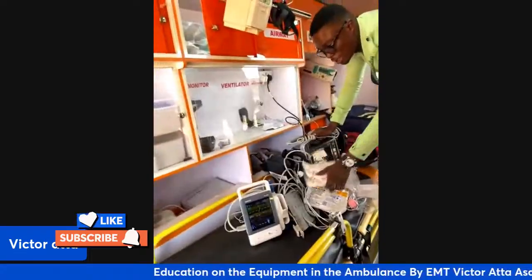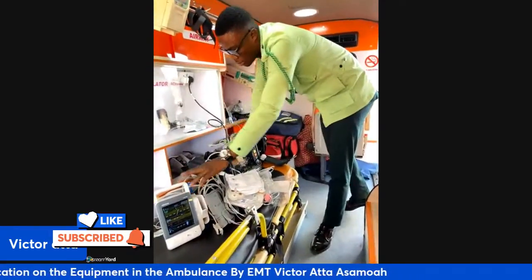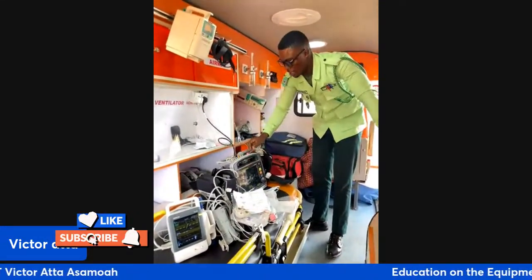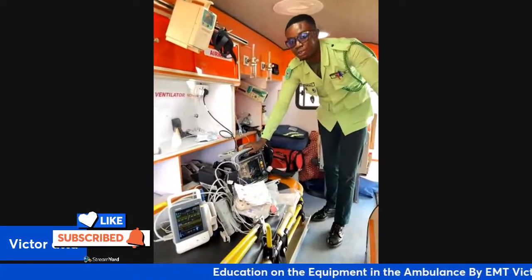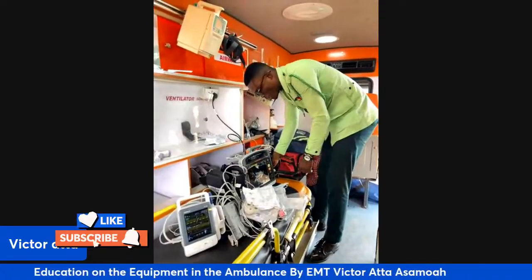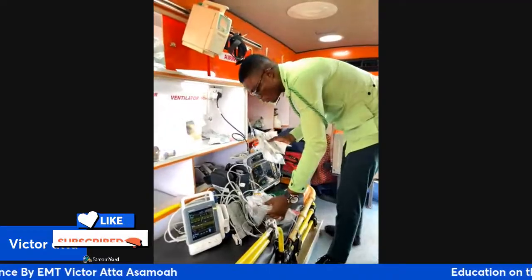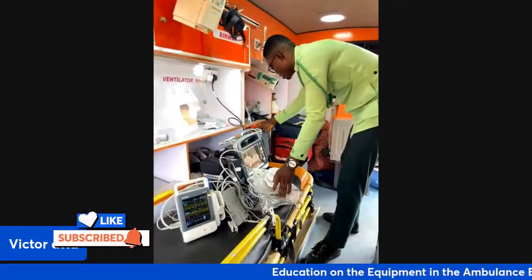So this machine is more advanced than the small machine. Anytime you're transporting the patient and you're using this advanced machine, it allows you to know what exactly is happening to the patient. Okay. So we are done with the cardiac monitor. We'll be moving on to different equipment in the ambulance.